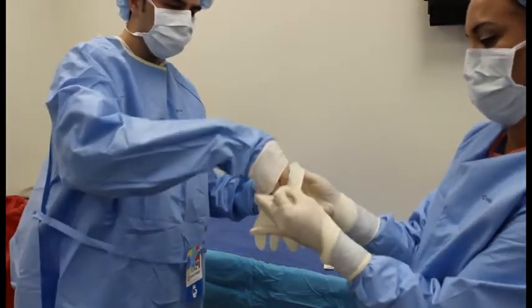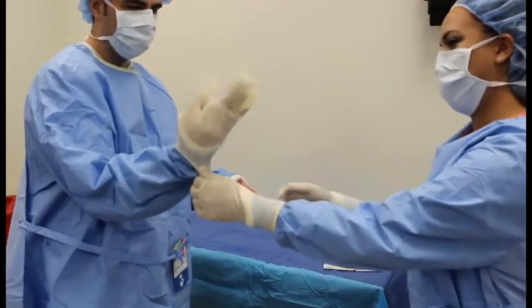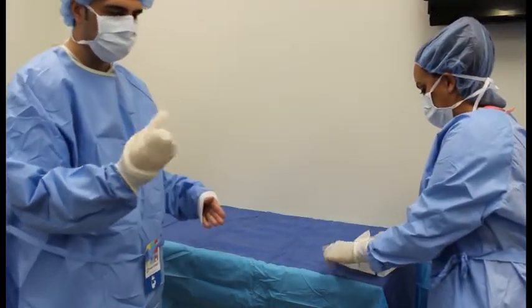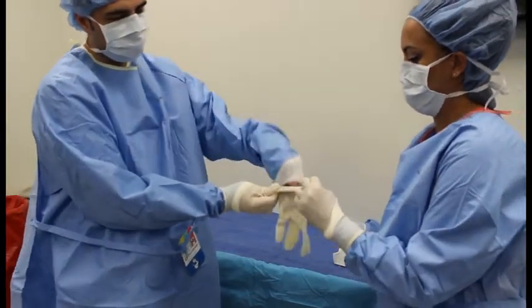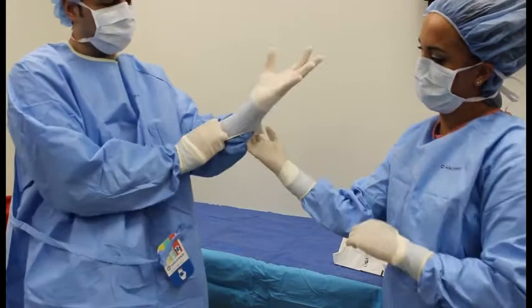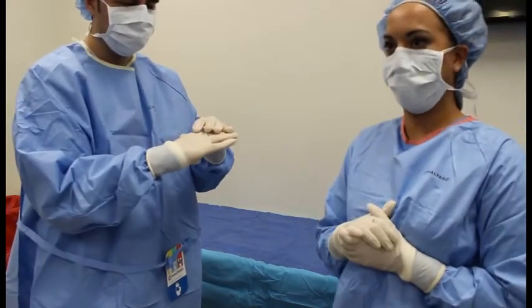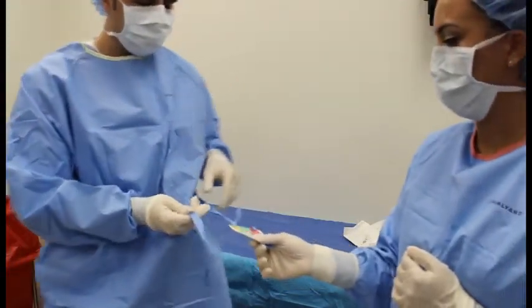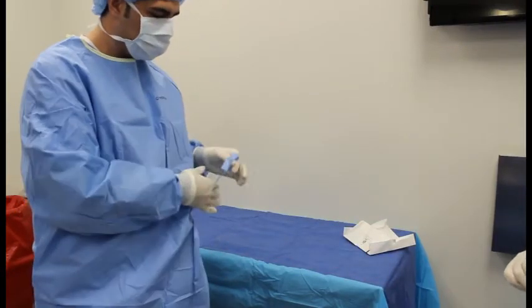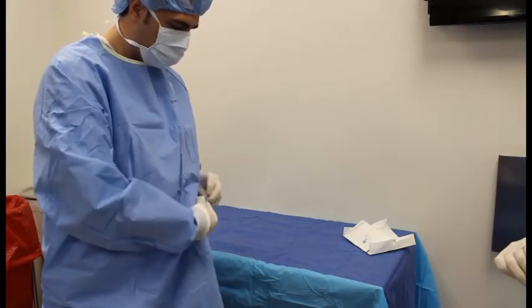Open the glove up wide so the surgeon can fit their hand in. When doing the left hand, the other team member can assist you in putting their glove on. Then we will begin to tie — pull the short side out and turn around.